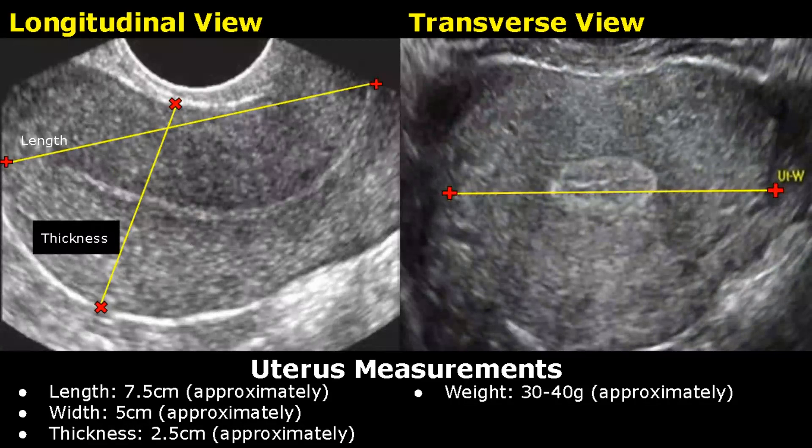These images are taken in transvaginal view. In the longitudinal view, one caliper is placed here at the top of the fundus and the other caliper is placed at the end of the cervix, right here. The thickness can be measured by placing the calipers in this manner.